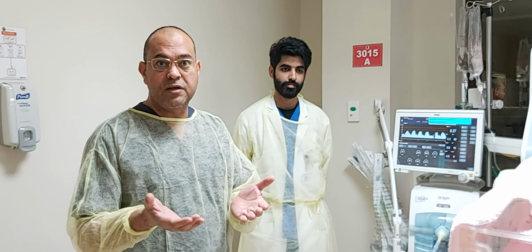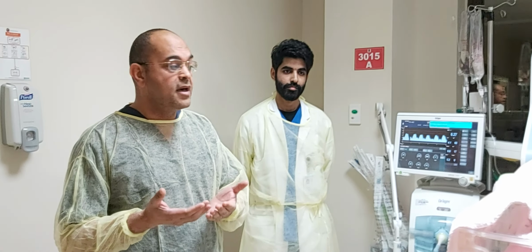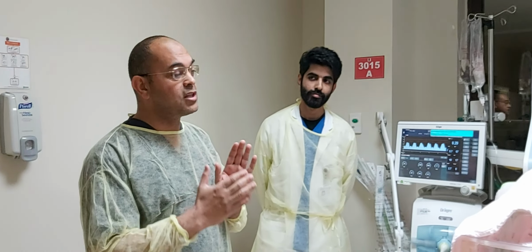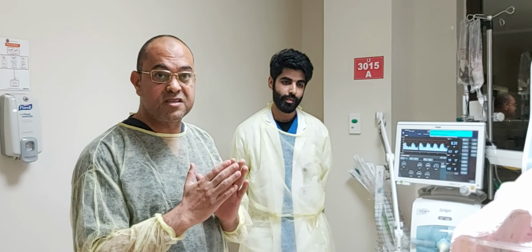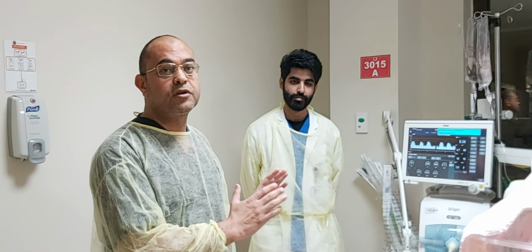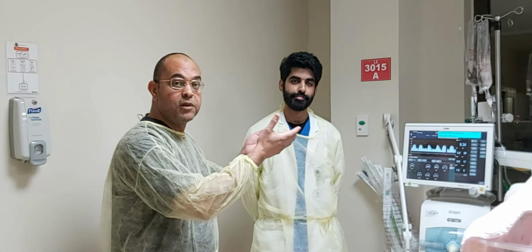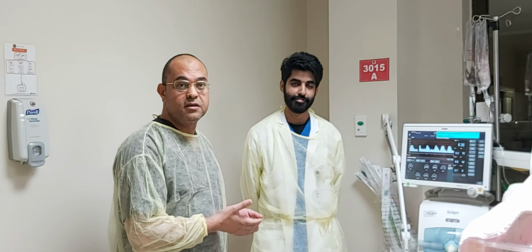We requested a blood gas, which showed respiratory acidosis, and we put him on conventional mechanical ventilation, but unfortunately the baby still desaturated and cannot maintain saturation with respiratory acidosis. So we decided to shift him from conventional mechanical ventilation to high frequency. Mr. Anas, our senior respiratory therapist, will tell us how to apply the high frequency.